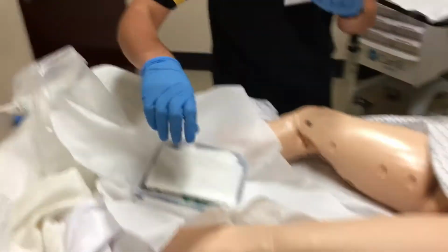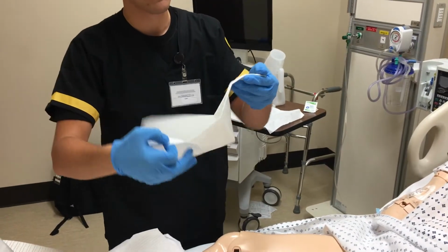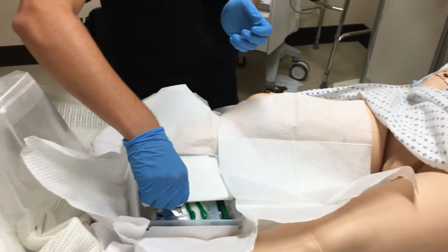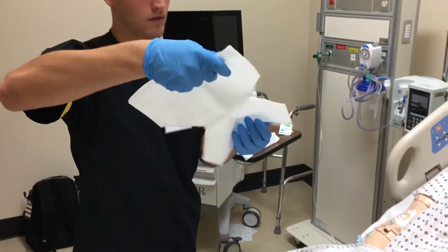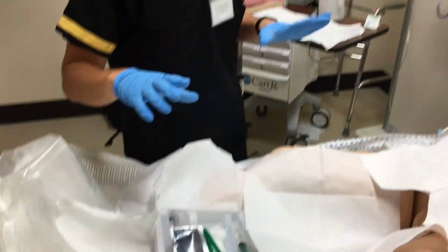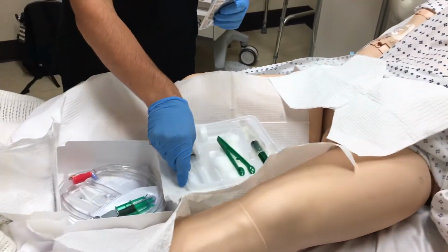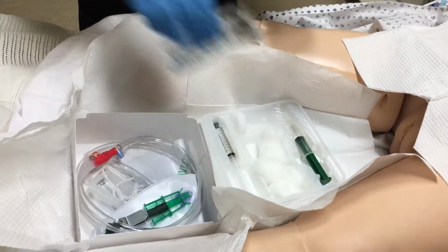Okay, gloves are on. We'll go ahead and set up these drapes. And I'll drop this top one right there. Okay, now what we're going to do is I'm going to get out this betadine. I'm going to move this over here a little bit if I can work. And I'm going to pour this betadine on my cotton balls.